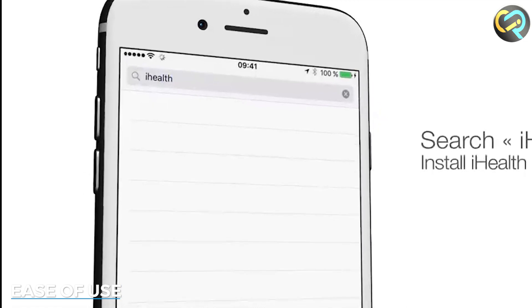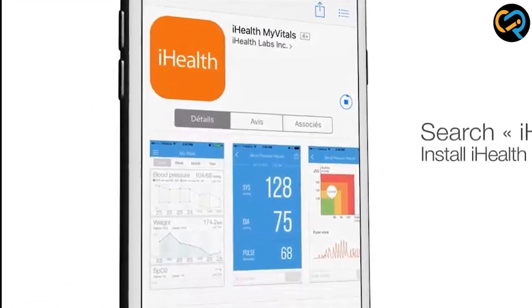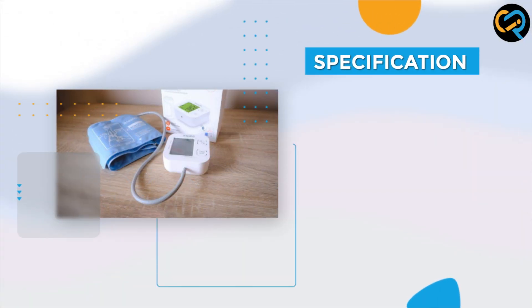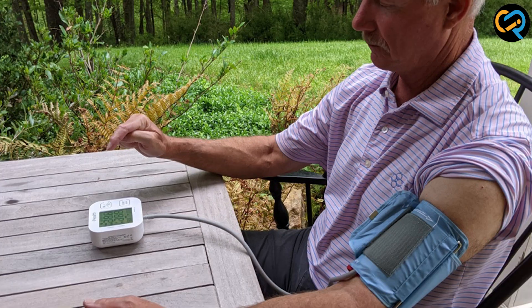The device comes with a companion app that you can download on your smartphone or tablet. Once you have installed the app, you can pair it with the device via Bluetooth. The app is intuitive and user-friendly, and it allows you to track your blood pressure readings over time so you can see how your blood pressure is trending.